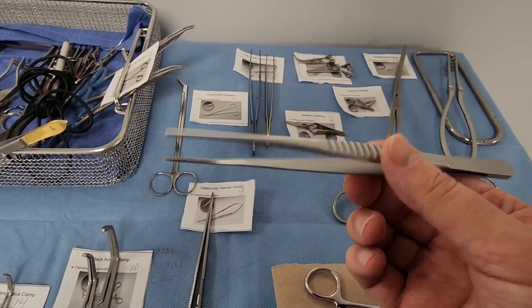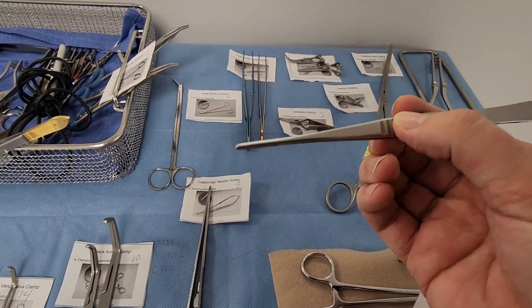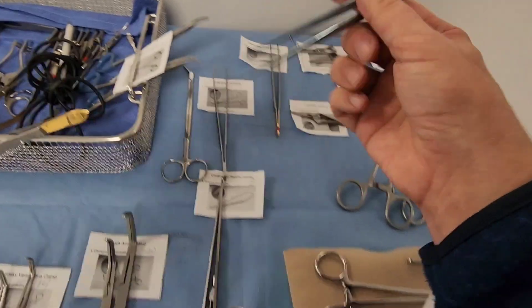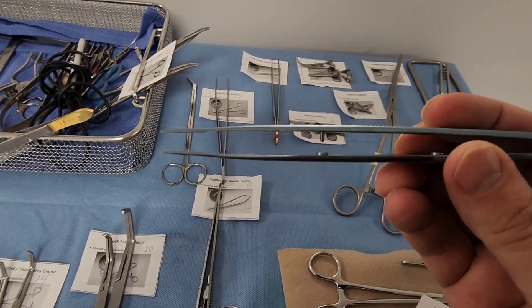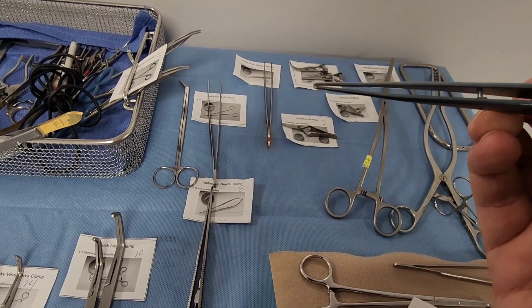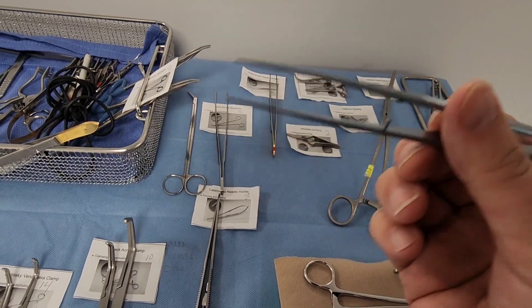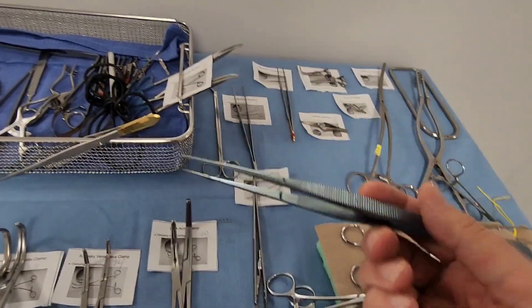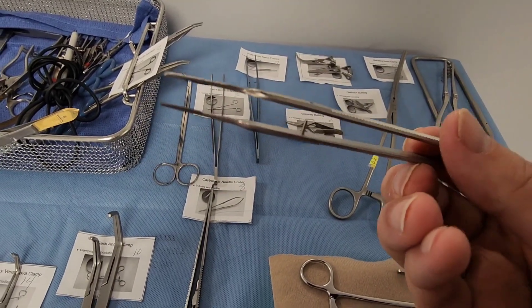For forceps, the DeBakey-type forcep is found in general trays but is especially used in vascular because it's designed for delicate tissues. We also have the Potts-Smith tissue forcep — you can recognize it by the unique mechanism in the middle that prevents too much trauma and locks slightly when it clicks. It's a little more fine than the DeBakey and is a common forcep for vascular work.